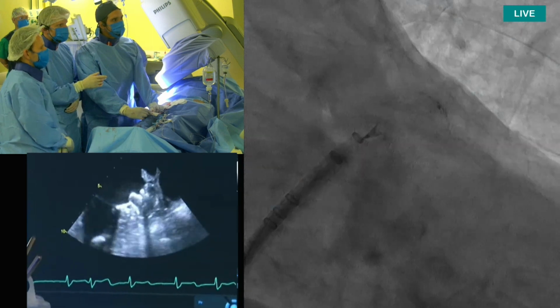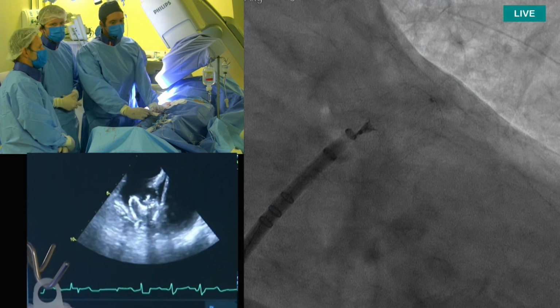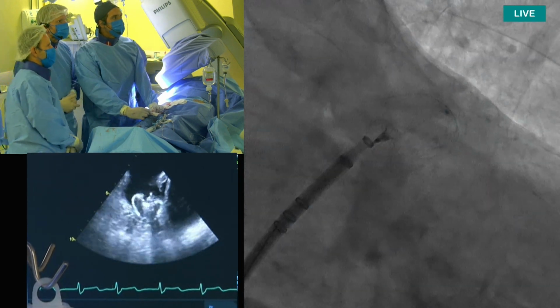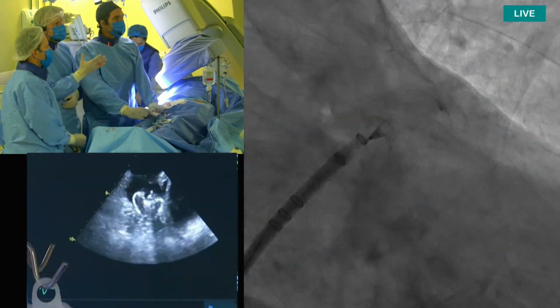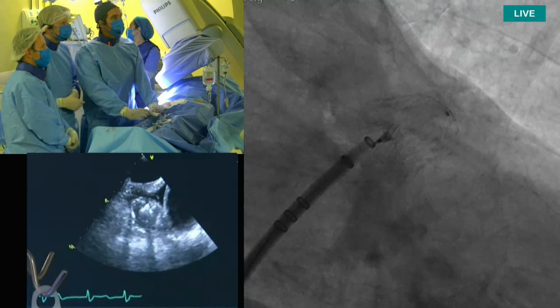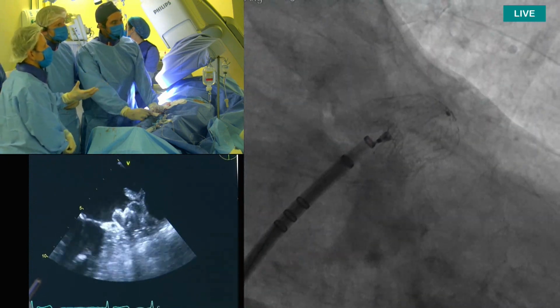Yeah, so actually really no shoulder, I would say, and we have the compression on echo, but I like even to see more on the fluoro. You can maybe give 1 second of cine just for the audience. Cine is always easier to see, higher quality. Is this a cine? Okay. We're live. So based on this, I would say we have that 15 to maximally. Yeah, indeed. So this is indeed that 15 to 20% compression, I would say, visually. So it's more than 10%. It's not 30%, but it's there in the middle. But that's great. That's good.